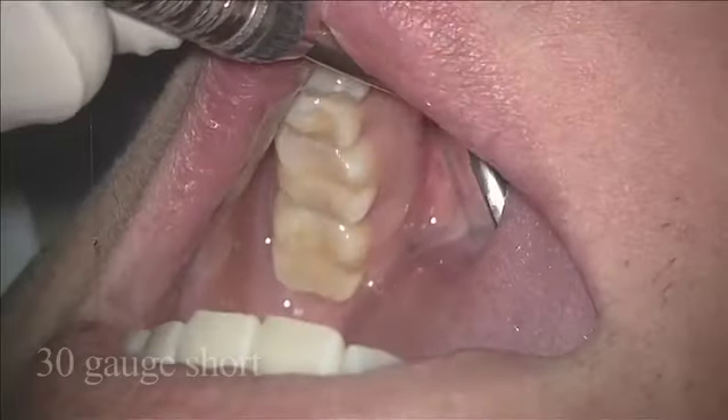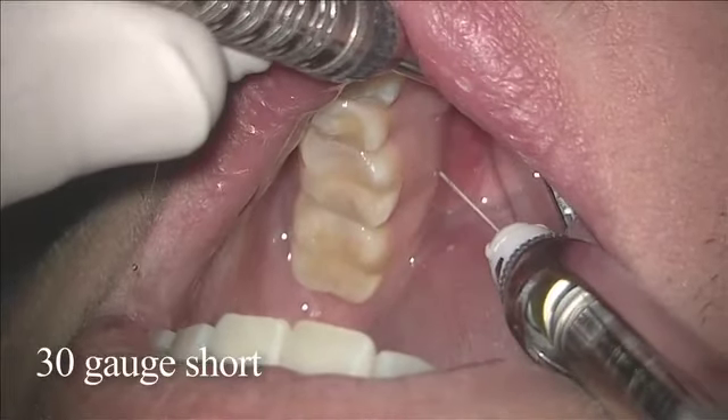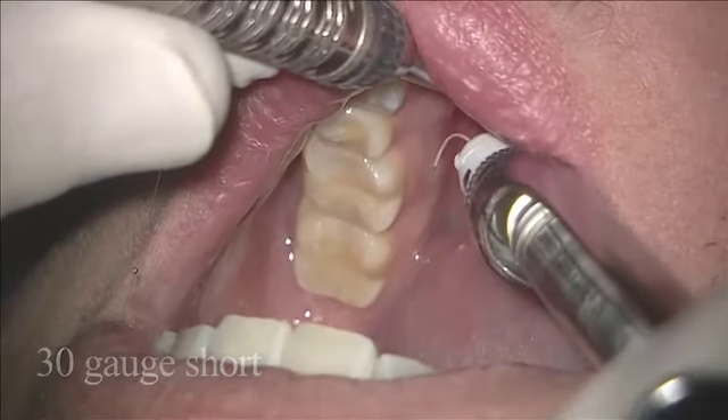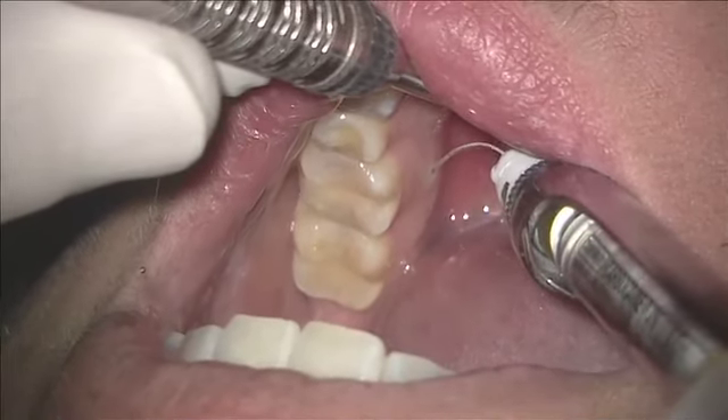The technique is to place the bevel of the needle towards the bone on the lingual attached gingiva. If we put it in the mucosa, it will balloon out and be less effective. When we put the bevel towards the bone and set it in the attached gingiva, it forces the solution under the periosteum.